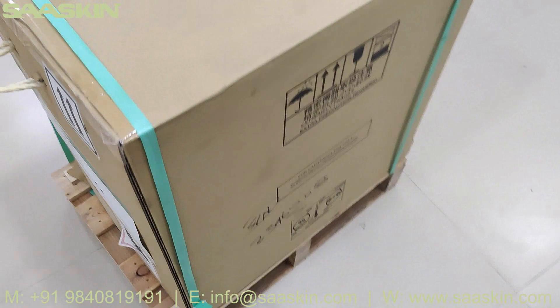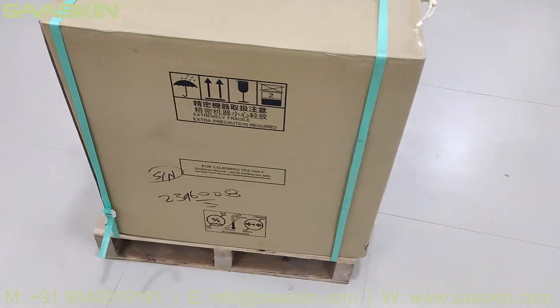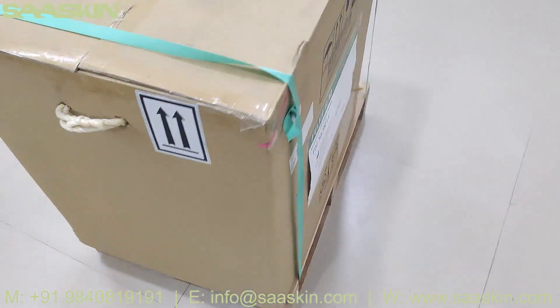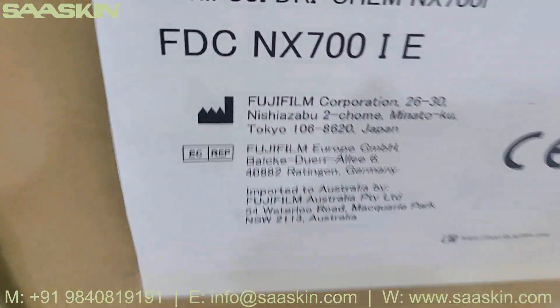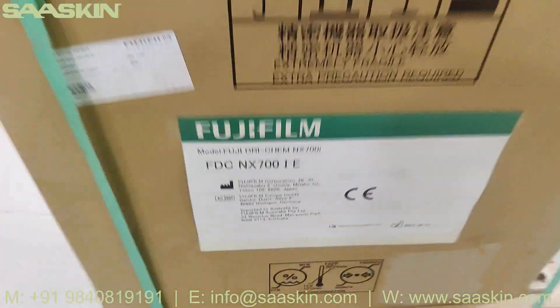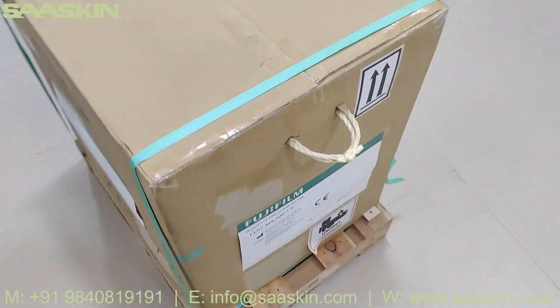Let me show you around the box — this is how the packing looks like. The other side also has writing on it. I am going to unbox this for you.